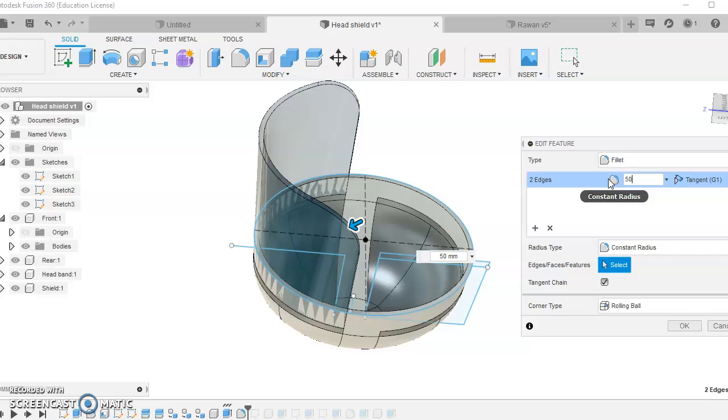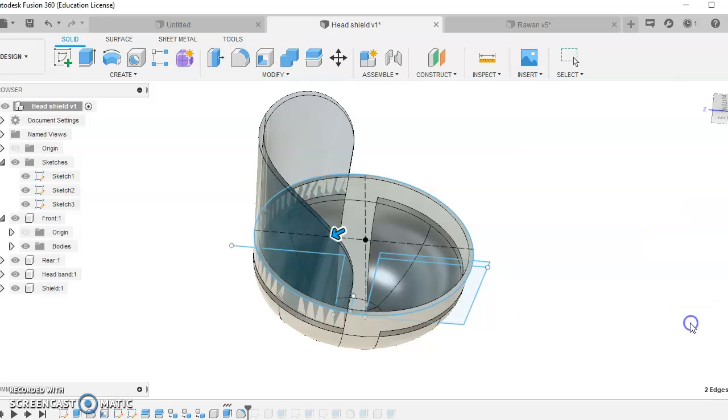Yeah, that looks a bit boring. Actually, it doesn't look aesthetically pleasing. So if you go for the 100, you get a nice flow. There you go. Perfect. Anyway, that's something you can change yourselves. Next phase, we're 7 minutes in, so we're getting there.